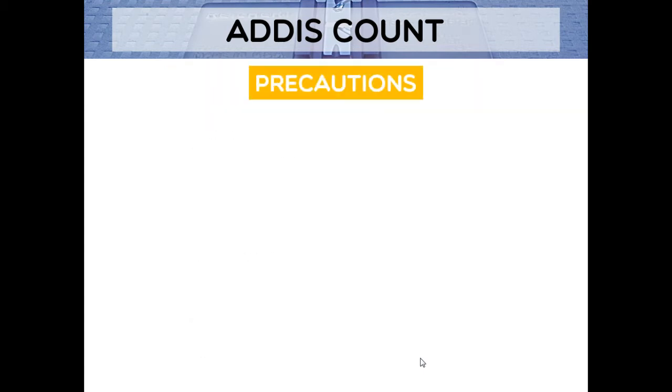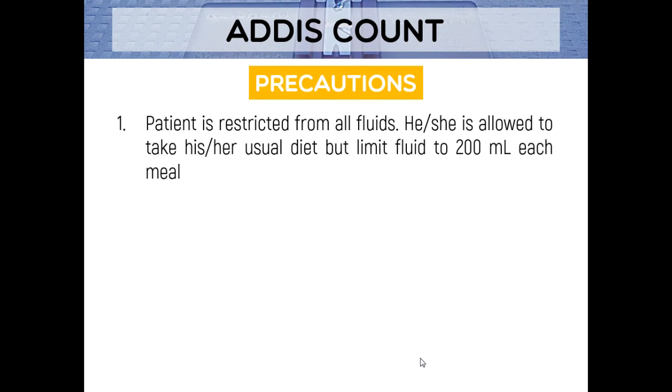Okay, all right. Now we go now to the precautions. Number one, the patient is restricted from all fluids. Usual diet lang but limit to 200 ml because again, we don't want na in a way ma-dilute ang atong mga cells na naa, which would subject our procedure to inaccuracy, or gamay na ng mga cells at makitaan. All right.